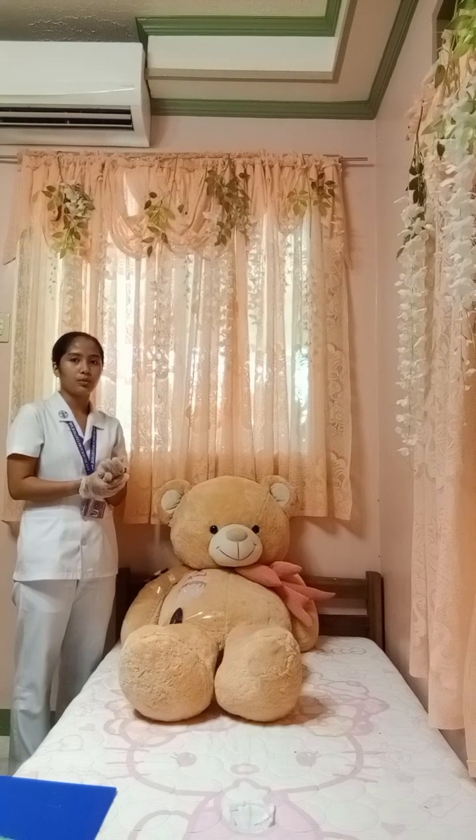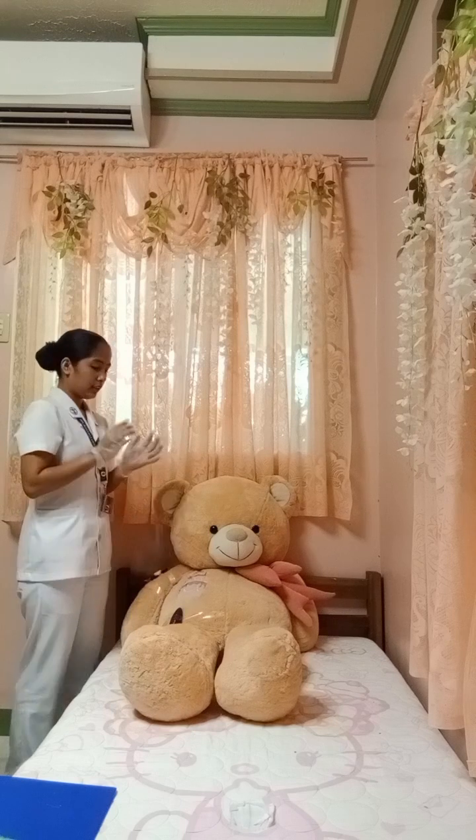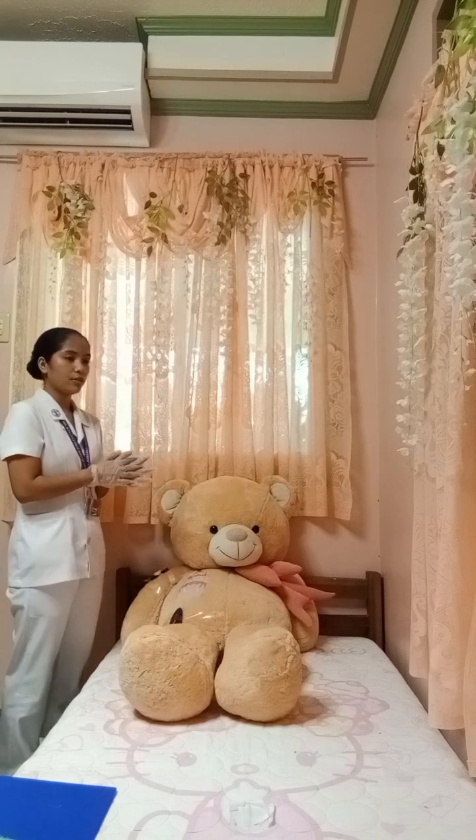Then don't forget to document all the needed information. This is to serve as a means of communication and to confirm the medication. Now we're going to proceed to the subcutaneous injection.